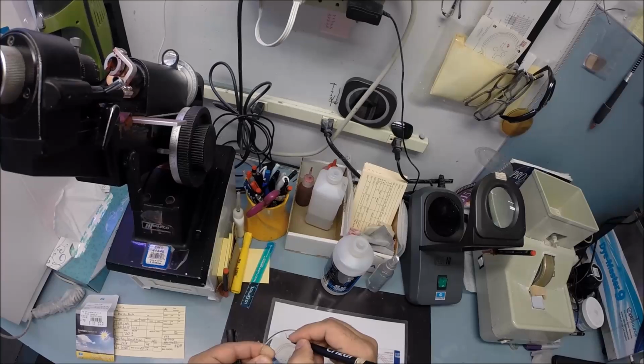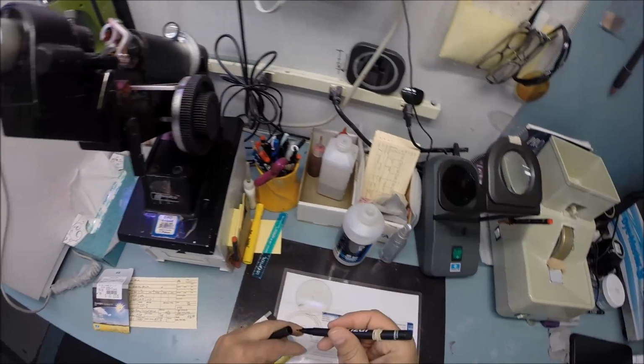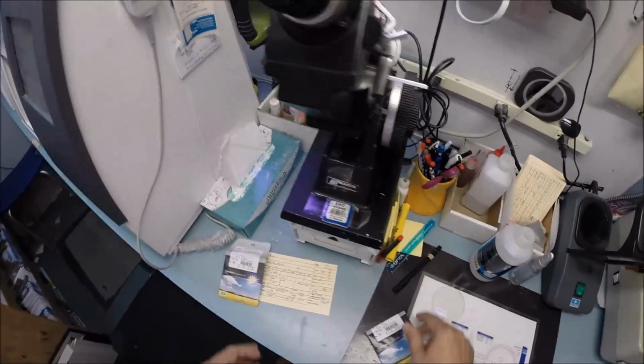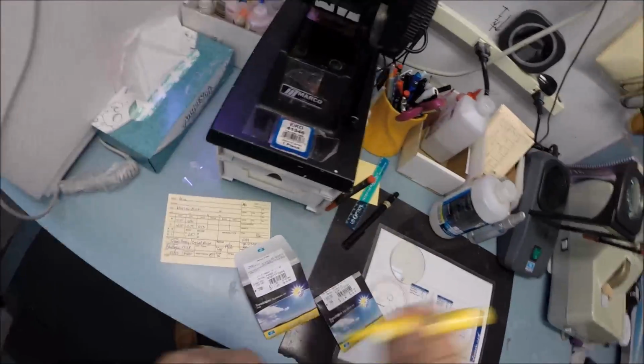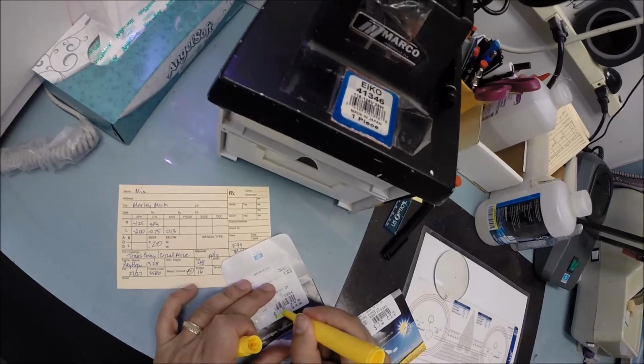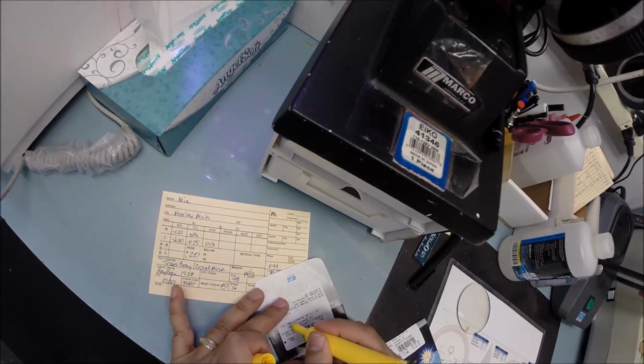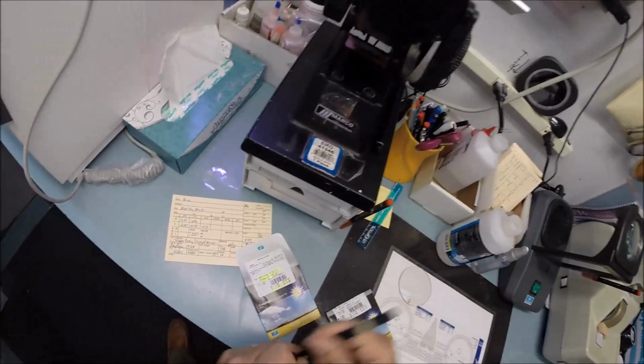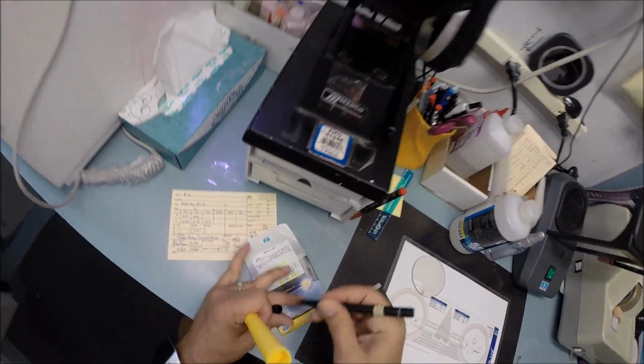And this is the right lens, so we'll put an R on there, or an upside down R when we turn it that way. Let me mark the lens. So again, -1 1/4. And these are the transitions gray with Crizal Avance for your right lens.